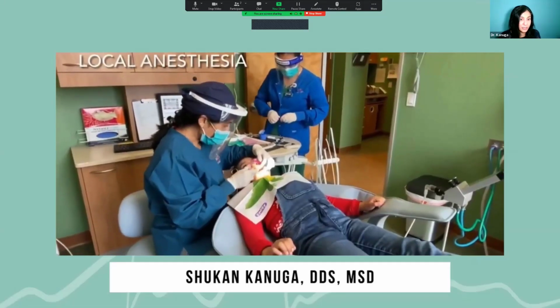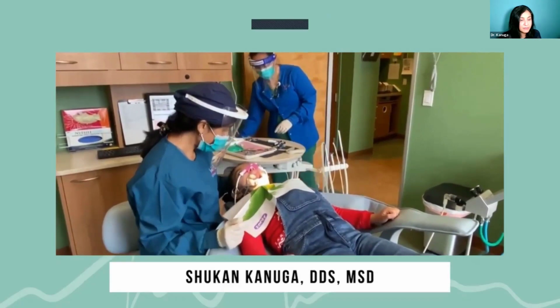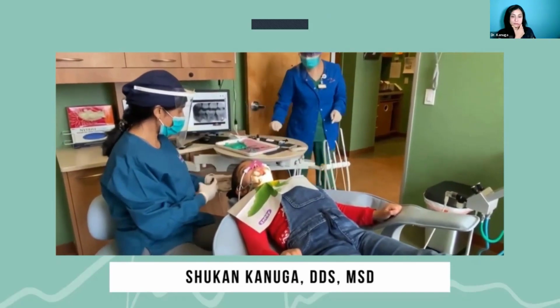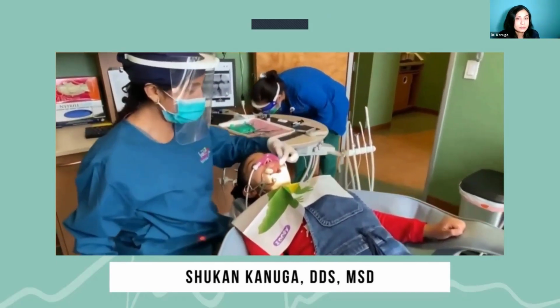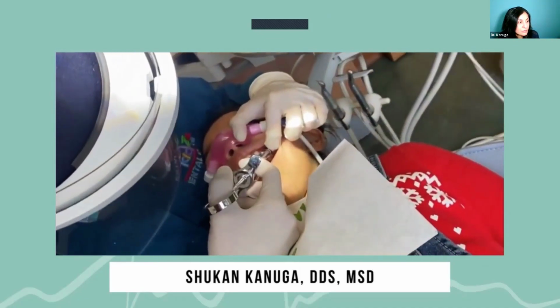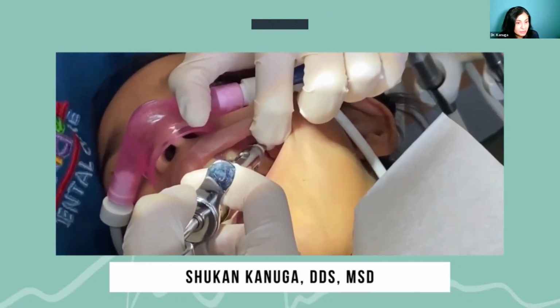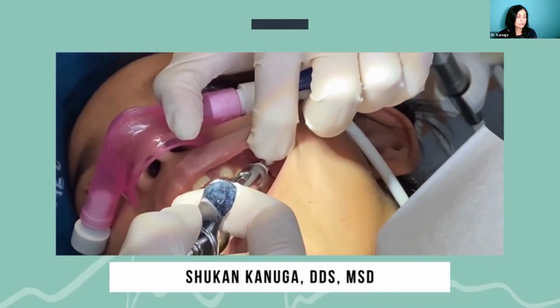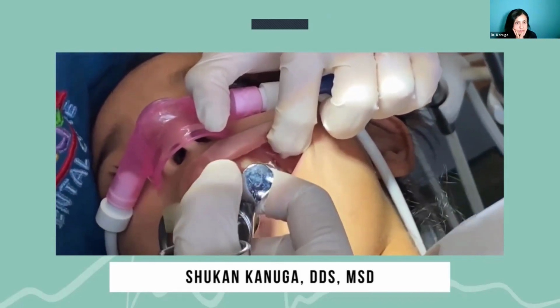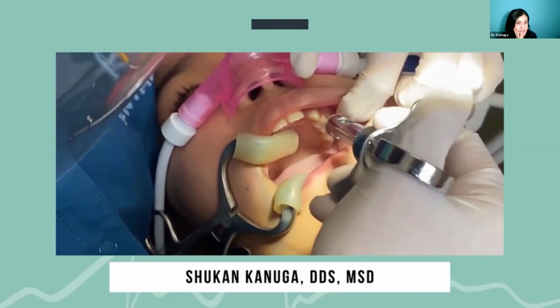I'm gonna put this little pillow to help you stay. And this is just a short one. Higher. And remember the rules. Very easy. As long as you keep looking at the TV on the top and keep breathing through your nose, we're gonna be done really fast. Okay? I'm gonna put a few drops of the cold sleepy juice in your gums. Take a nice big breath in and out. Perfect. Can you do that one more time? Wow, I can see your tummy going up and down. I love how you're breathing through your nose and staying still like a statue. That is perfect. Great job.